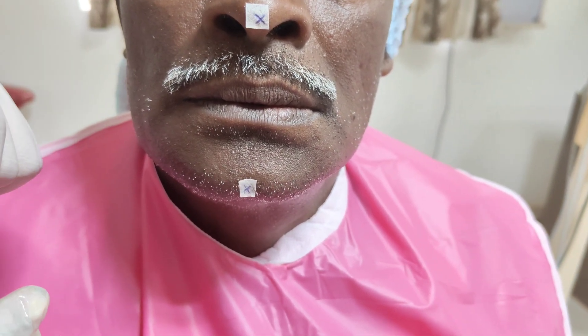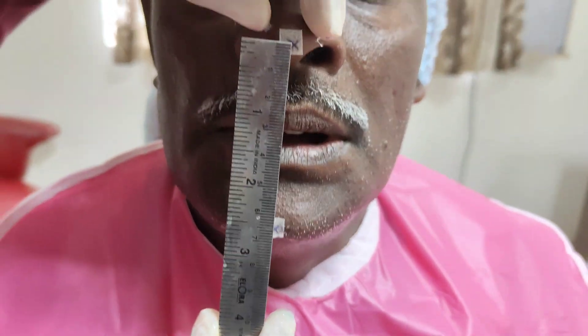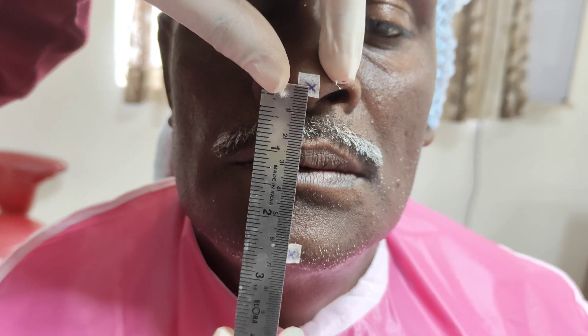After checking retention and stability, occlusion has to be checked. The prominent point on the chin and the prominent point on the nose are marked first. To assess the vertical dimension at rest, the patient is asked to say 'M' several times, and the vertical dimension at rest is then measured.